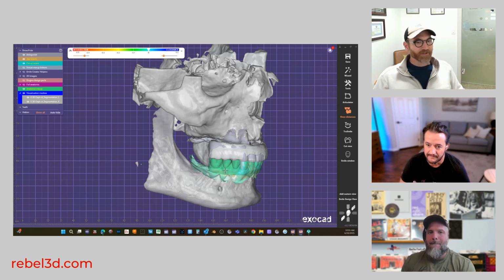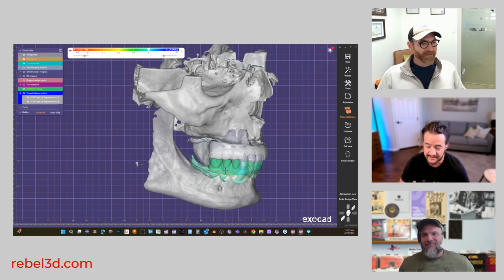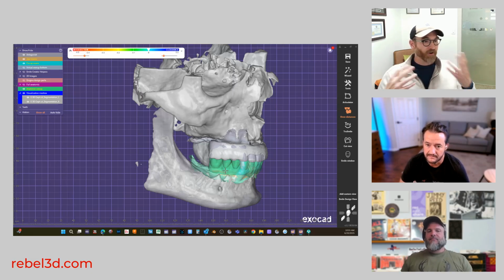Yeah, and absolutely, man. And I assume you use CBCT on 100% of your full arch cases then? Yeah, absolutely. Even though I'm not even the surgeon, we're going to collect as much anatomical data as we can. So we're screening for pathology, looking at the overall health too.